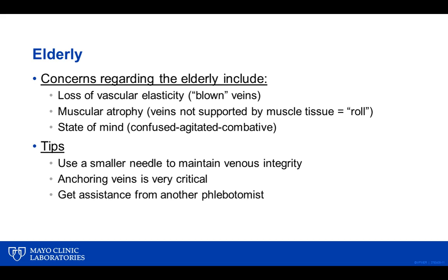Assistance from another phlebotomist. Some patients get very combative. It might take another phlebotomist, a nurse, or doctors just to keep them under control so they're not moving around, and you might hurt them that way.